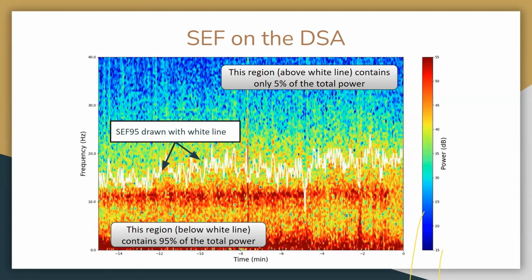There's different types of signals where it might represent different things, but the sound analogy is what I think is most intuitive. A louder signal is going to have more power. A quieter signal is going to have lower power. So I'd expect those quiet values to be in the blue hues and the red hues to be my particularly loud sections. Thank you. Any other comments or questions?